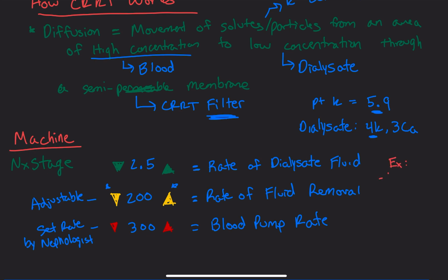Example: goal is even to negative 50 mLs an hour, right? You're going to calculate all the drips that your patient is on and how many mLs an hour they are running. That goes in, as well as something like tube feeds, if they have an NG tube and are receiving feeds. So anything going in has to be accounted for.